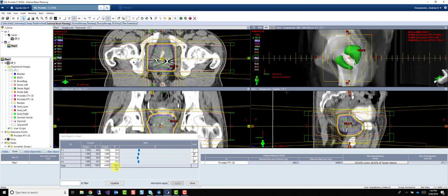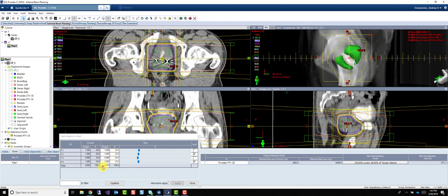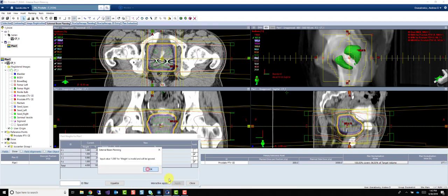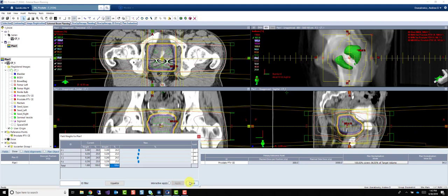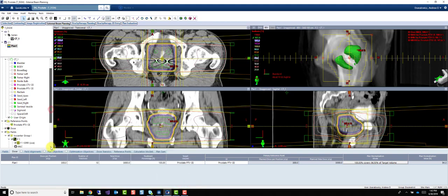What I'm also going to do while I have this open is you can see it's normalizing based on a scale of 4 since we have 4 beams. Let's turn that to 1. I need to unlock these first. Now I can do it.